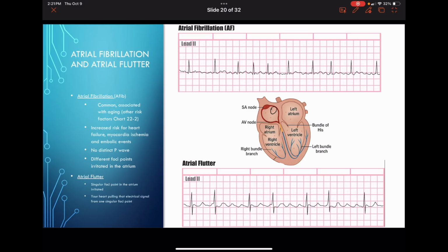So that's what causes it to be more consistent in your heart rate, or more like, as Quaid said, mountain points. It's because by stemming it from one, it has a stronger signal to send down, which gives you higher peaks, whereas with atrial fib, because they're all firing rapidly, there are smaller electrical impulses in order to send it down.